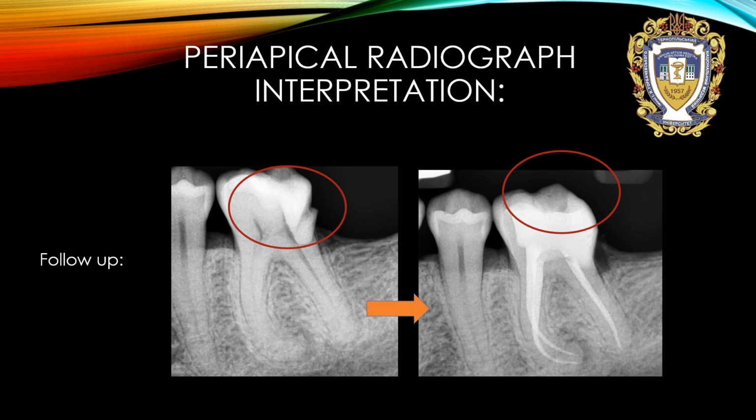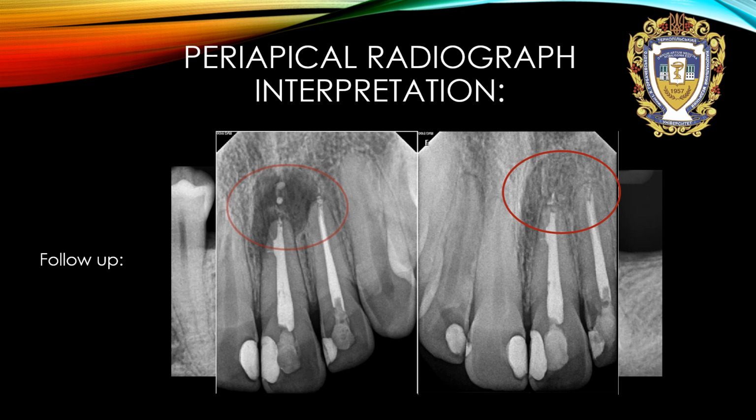The next purpose of periapical radiograph in X-rays is follow up. We can observe the treatment process before root canal treatment and after root canal treatment, or results of our treatment, some granulomas or cysts.